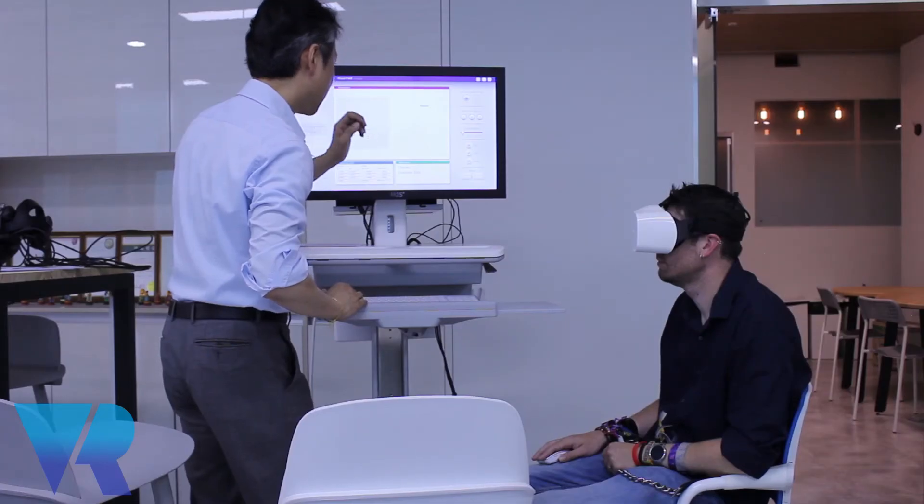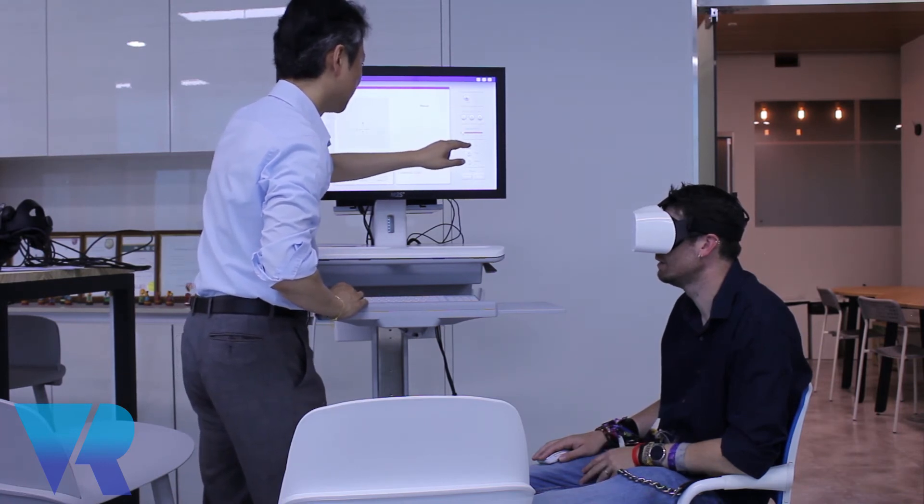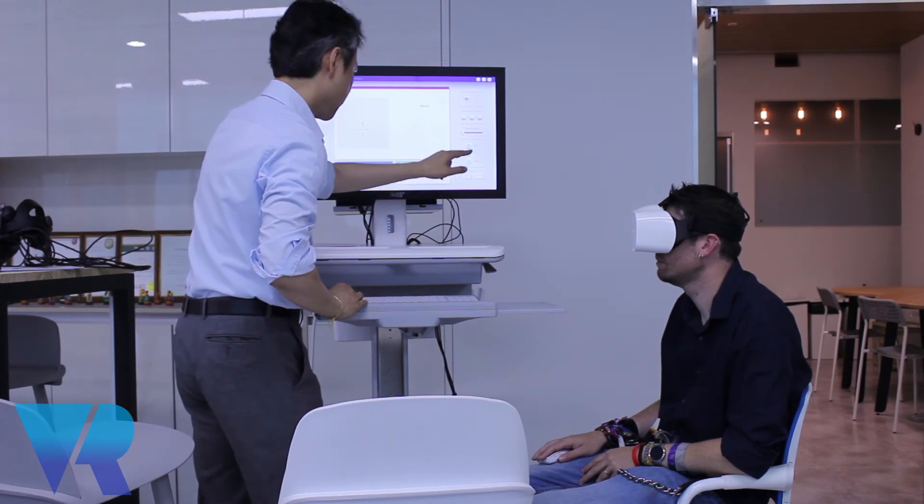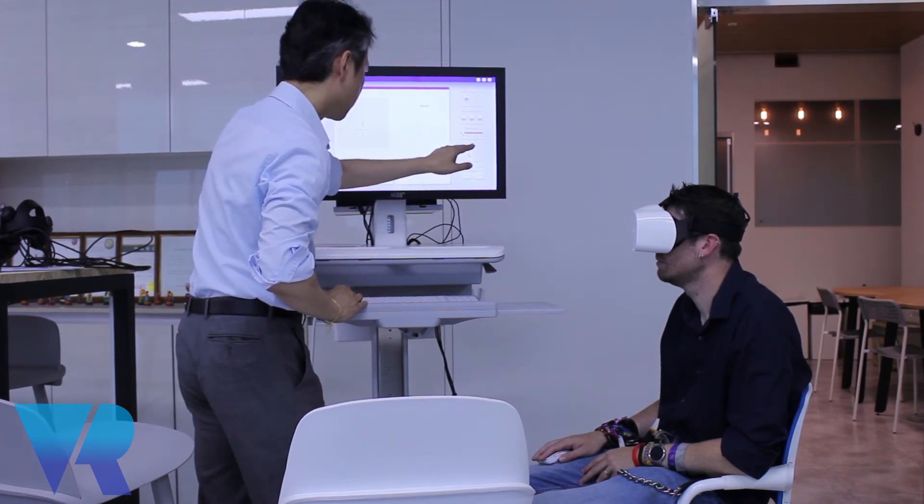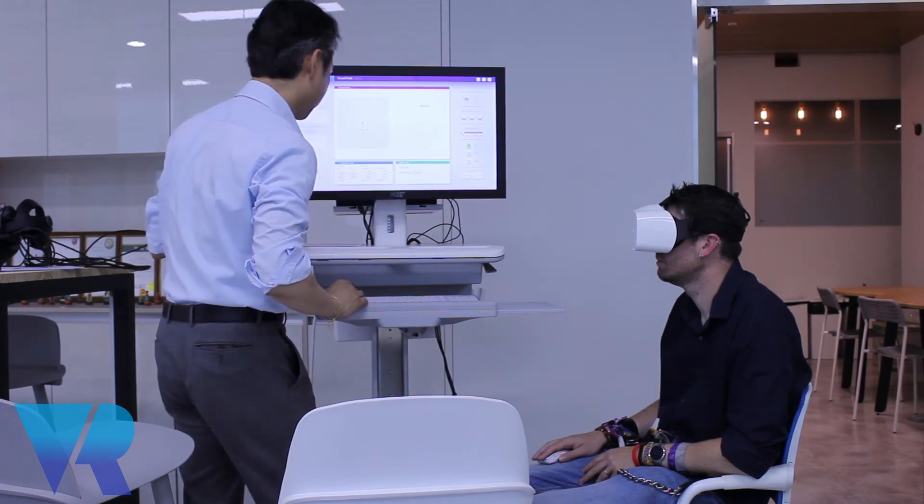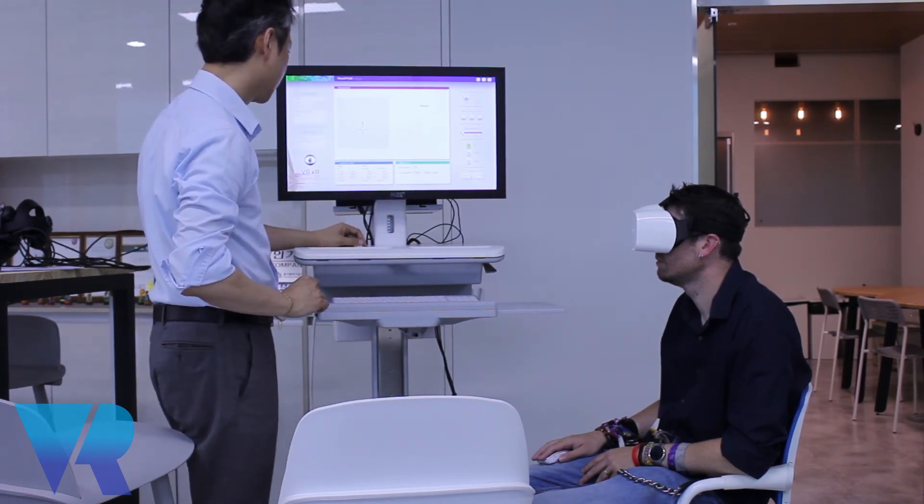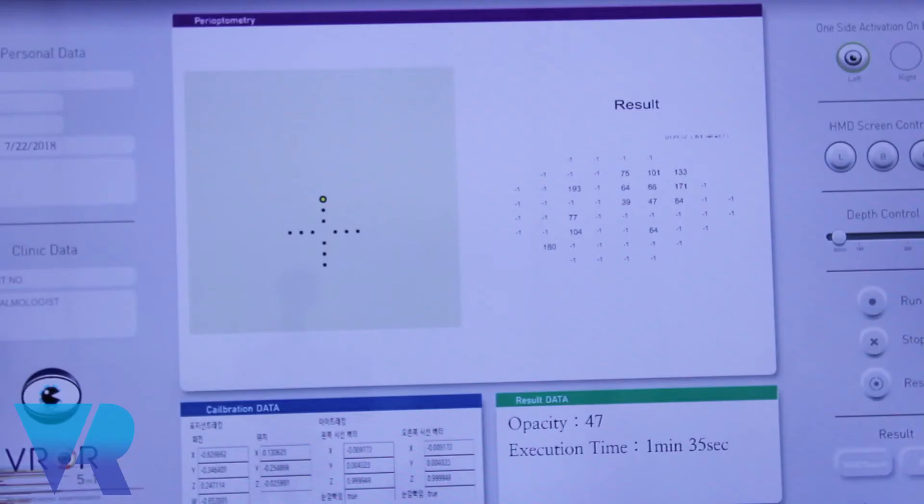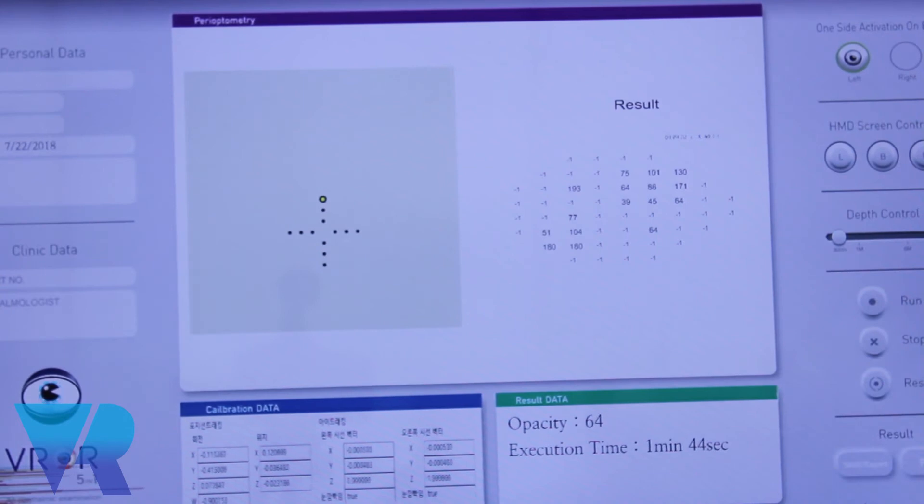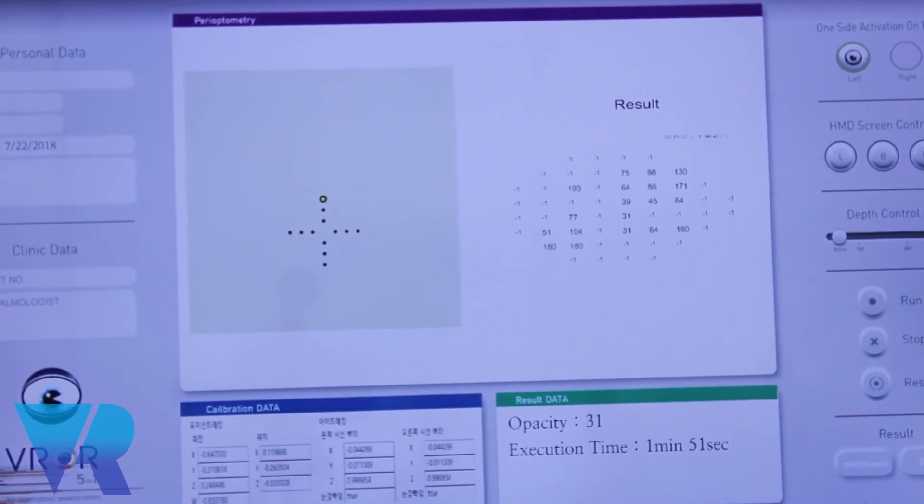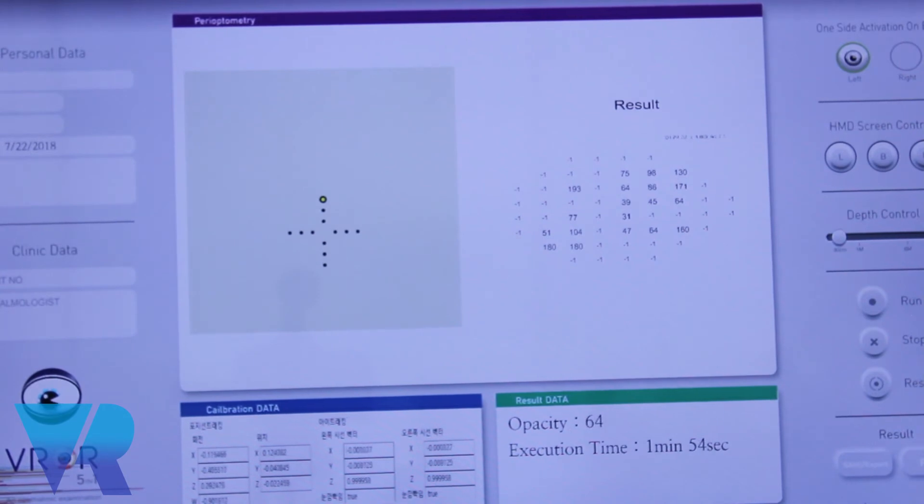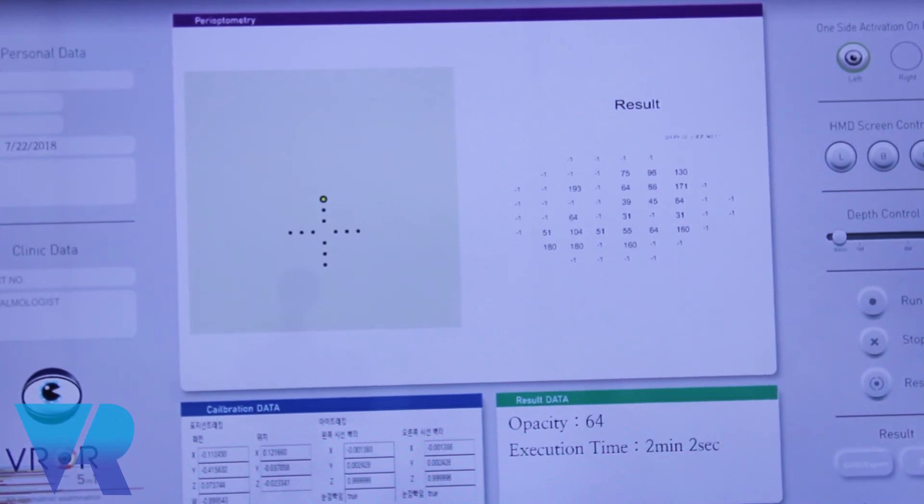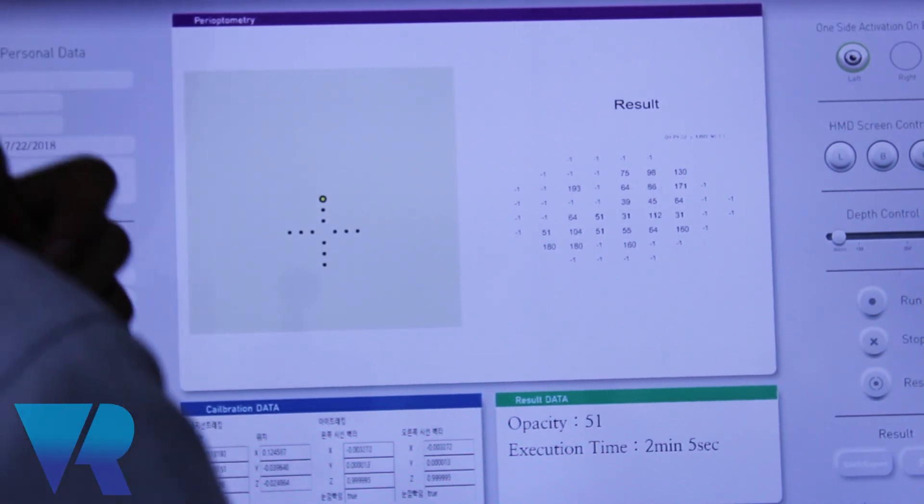Well my left eye is clearly weaker, isn't it? Yeah. So let's go with left eye then. If you feel any white dot, click it. Is it literally just this for 10 minutes? Yeah, it takes usually 10 minutes. Will you get a result after just a minute even if it's not particularly accurate? After testing for like one minute, you get instantly, you get the result. But obviously it's not going to be as accurate if you do it for 10 minutes, but you still get results. Shall we do like a minute on each eye then so I can compare my two eyes?